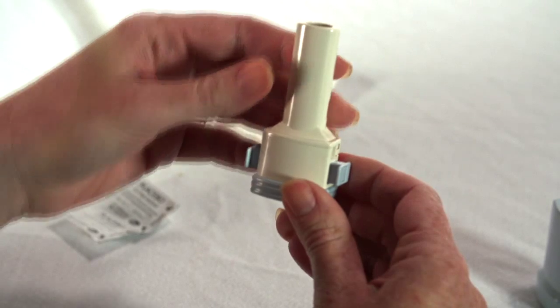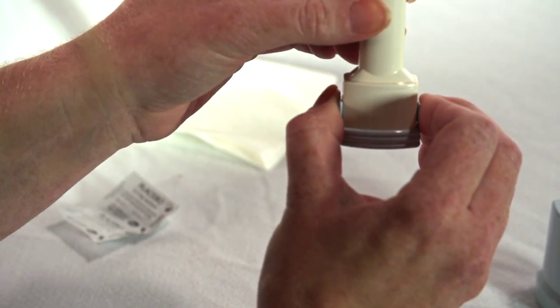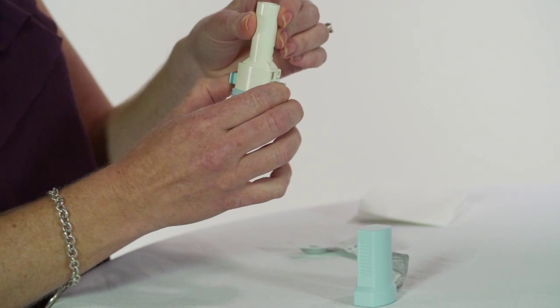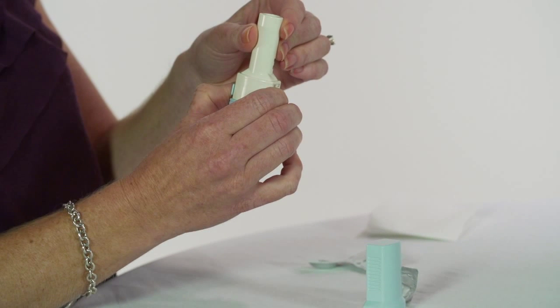Hold the Airelyzer upright. Squeeze the two side buttons to puncture the capsule. This piercing action allows the medicine to be released when the patient inhales.